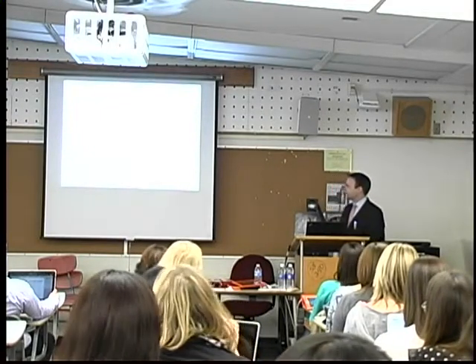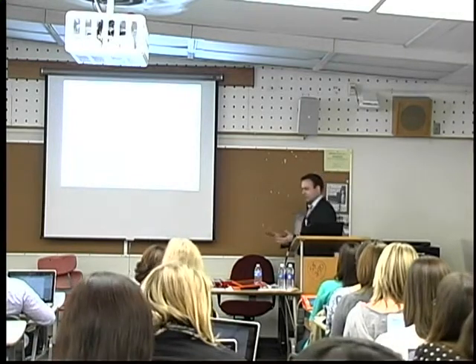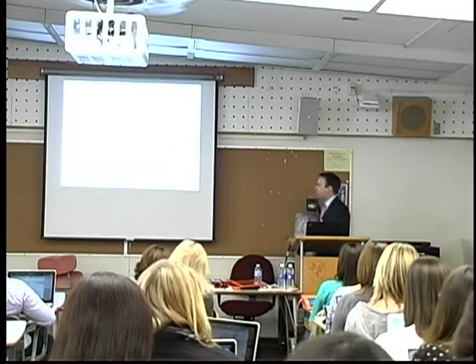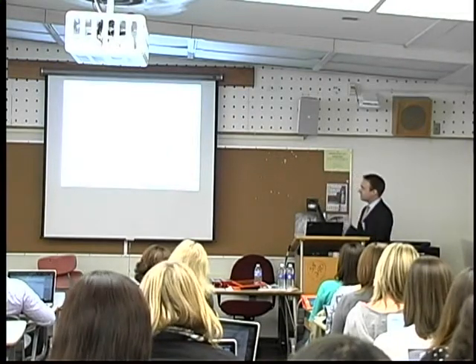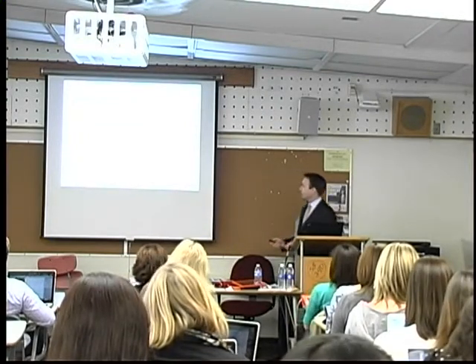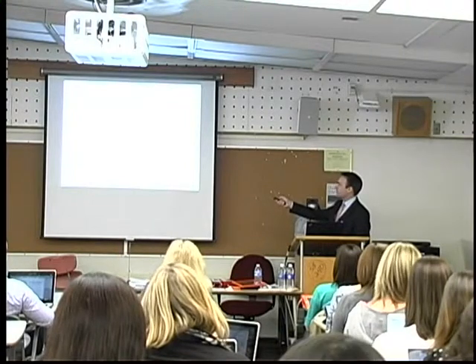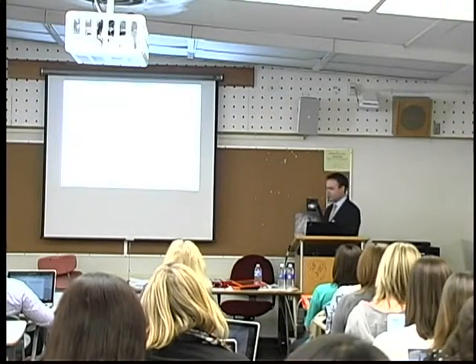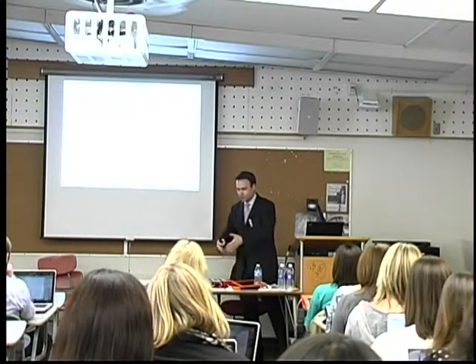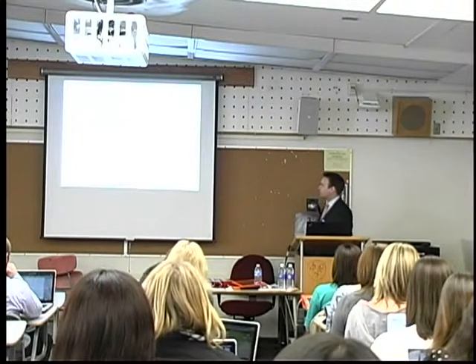Okay. Good. Moving on, how do we now make a transition? We've engaged in more low-tech strategies such as PECS, such as communication boards. How can we move on to speech-generating devices? That has been a research question we have recently pursued in my research lab. Earlier on, practitioners and parents were asking after successful mastery of these PECS phases. A lot of kids in our school district, PECS is often the initial AAC strategy to start out with. How can we then move on to an SGD?